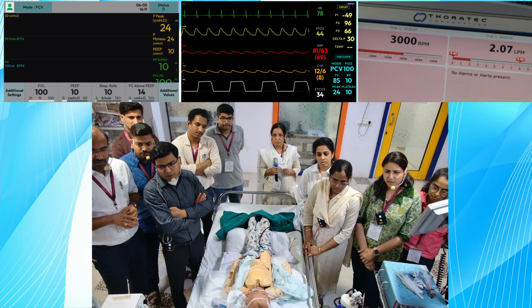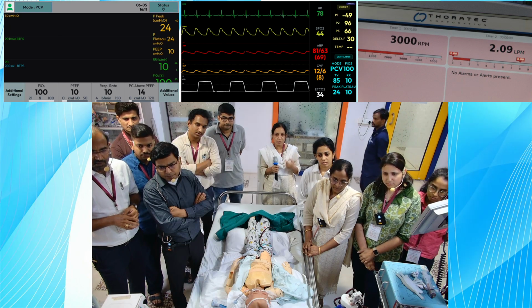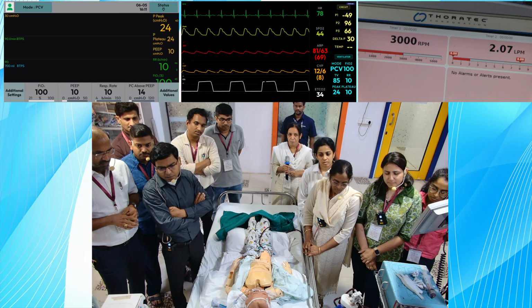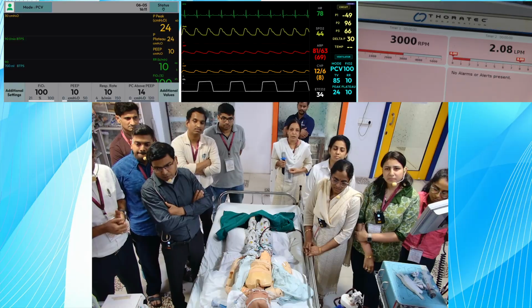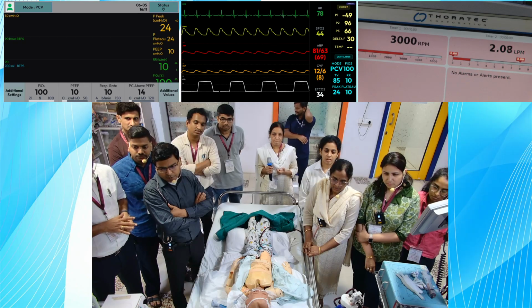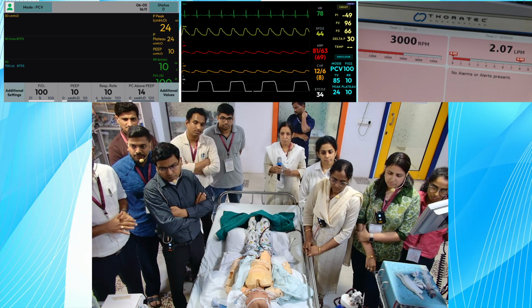So something is wrong with the oxygenator. Now you feel something is wrong with the oxygenator, so we'll plan for changing the oxygenator. On what basis? The pre and post membrane pressures are not that high. Pre-oxygenator, post-oxygenator delta pressure is normal, static. Okay. You didn't find any clot in the oxygenator. Okay.